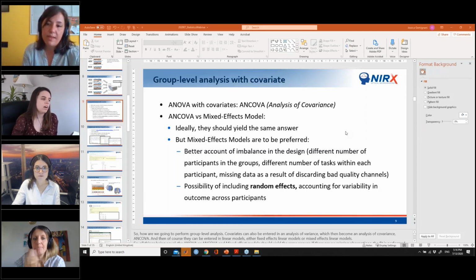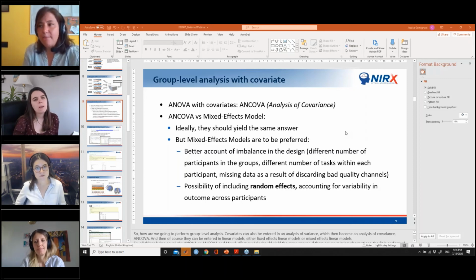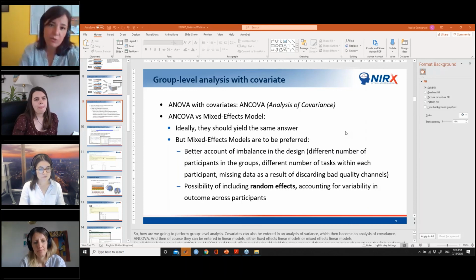And then I don't... Maybe you asked the second part, but I don't remember. The DPF and the PPF. Yes. I think in the NIRS Lab we use like 6, 7, 6.3, 7.2, and the 6 is the most used DPF.